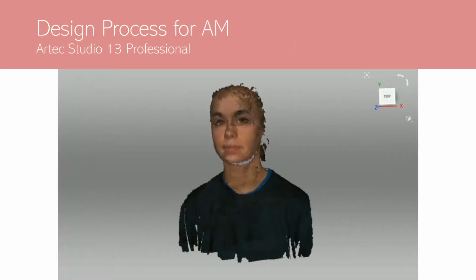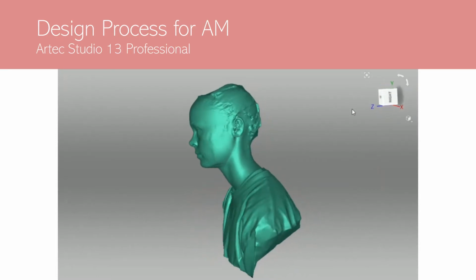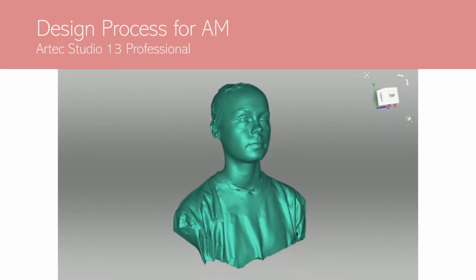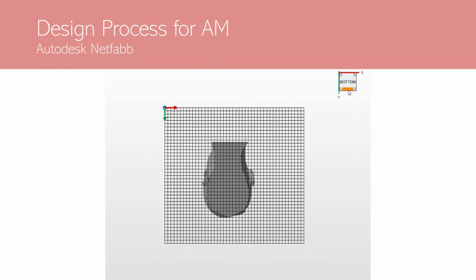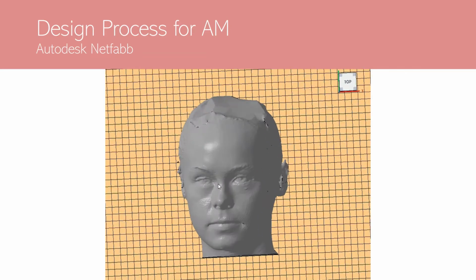For the design, patient data was collected by 3D scanning using a handheld scanner. 4 different scans were taken, and these were then processed, including removing frames of large errors to produce a single mesh, which was then exported as an STL file. The mesh was imported into Autodesk NetFab, where it was simplified by removing errors not necessary for the design and converted from a mesh into a B-rep model suitable for computer-aided design or CAD.